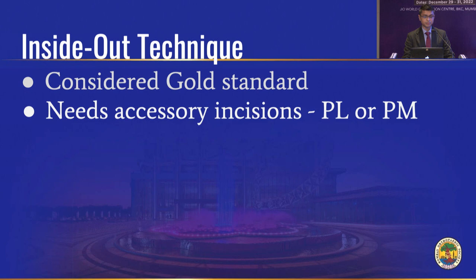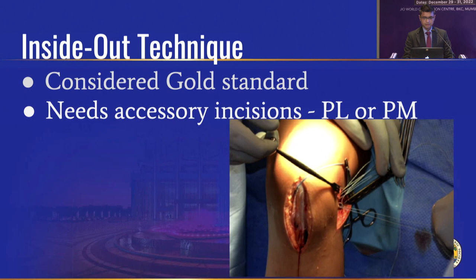These, because the entry point is known but the exit point is blind, need accessory incisions, posterolateral or posteromedial, depending on which meniscus is being treated. This is just an image of that.